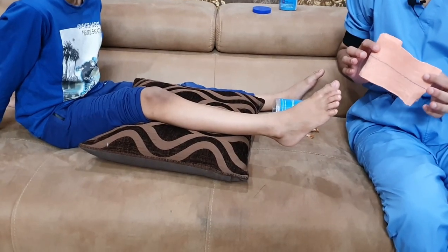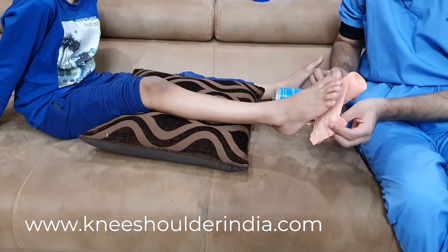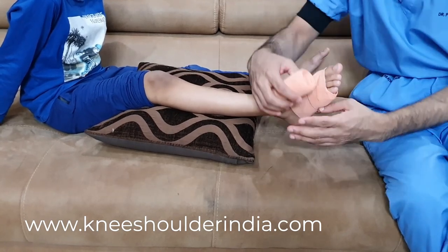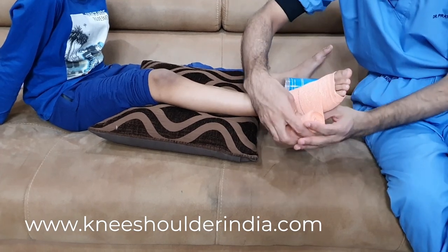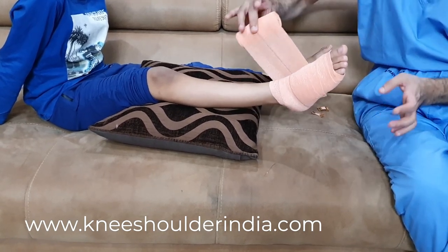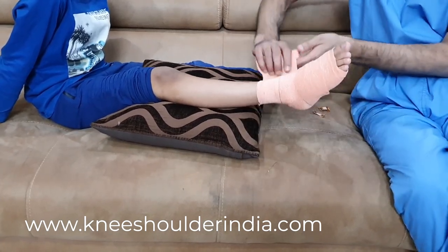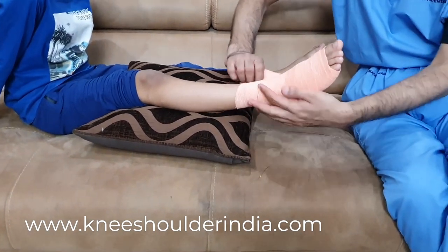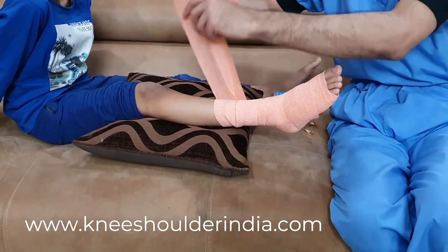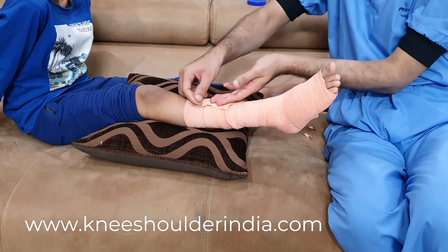For venous insufficiency, how do you tie a crepe bandage? If you have venous insufficiency, you need to tie the crepe bandage from low to high. First tie at the lowest portion and go upward, covering two-thirds of the previous layer, always holding it so rolling is comfortable. Never go from top to bottom — always go from bottom to top. Continue covering it completely in this fashion.